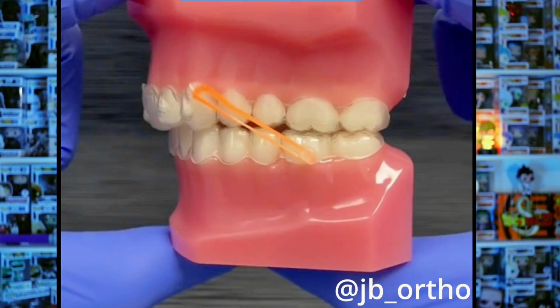That was a long 50 weeks. Not trying to scare you, just making sure you know that's a possibility. You might end up needing rubber bands. I've actually seen people have multiple rubber bands during their Invisalign treatment. Like everything I'm telling you, you get used to it. It's not that big a deal, and it's worth it.